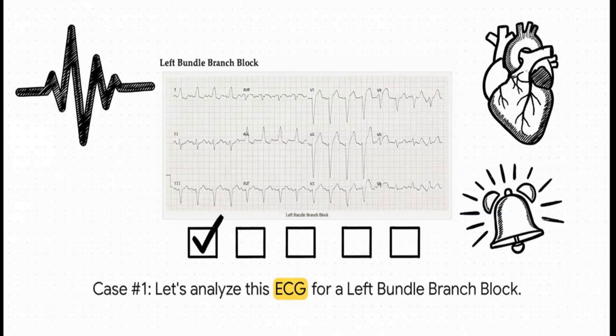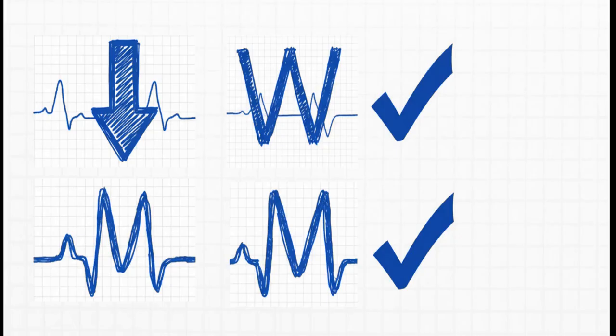So here it is, our first 12 lead. First thing you notice, right? The QRS is definitely wide. So those alarm bells for a bundle branch block should be ringing loud and clear. Now let's just apply our checklist. Okay, step 1, let's look at V1. Is that final deflection pointing up or down? It's clearly going down. That's a left turn signal.